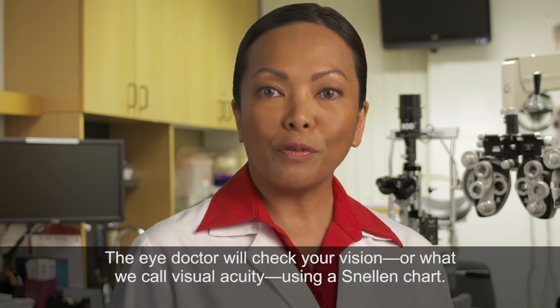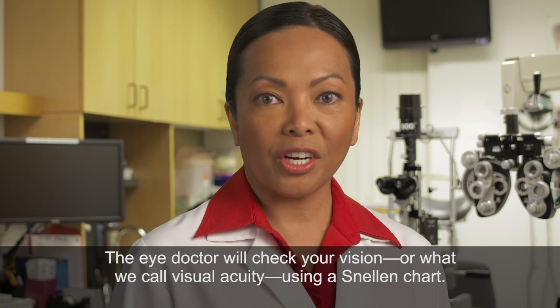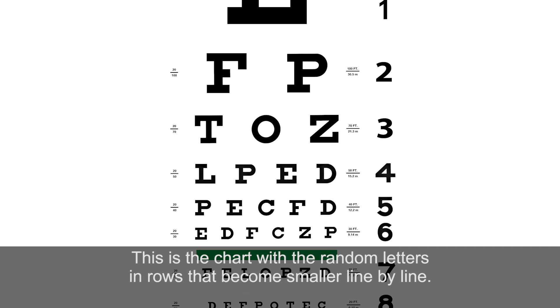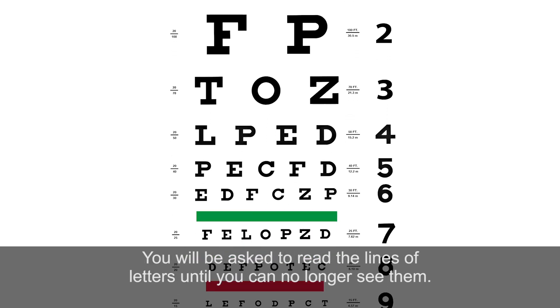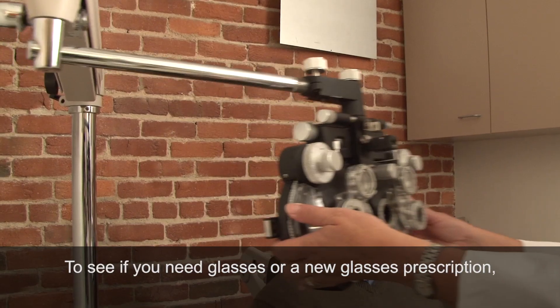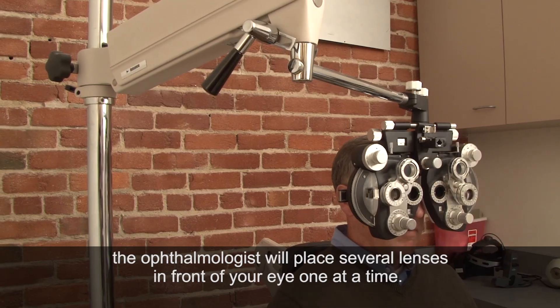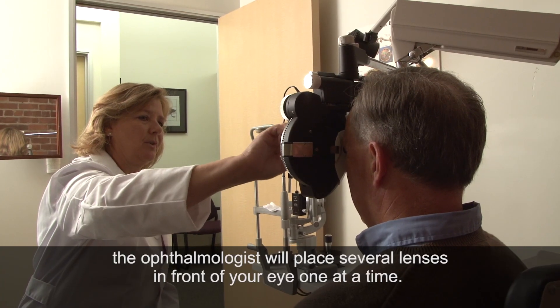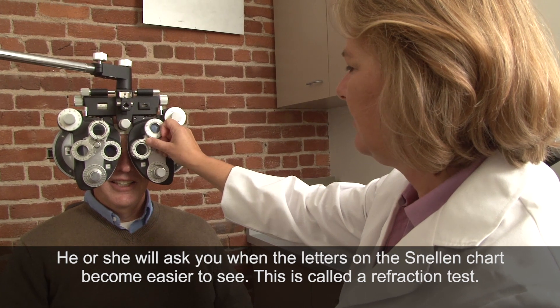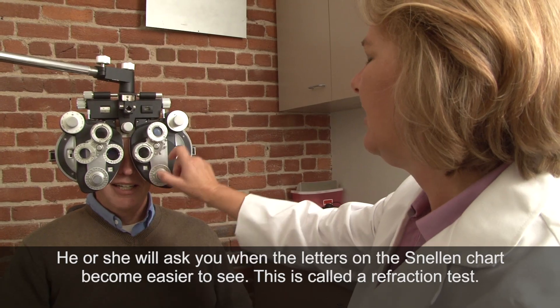The eye doctor will check your vision, or what we call visual acuity, using a Snellen chart. This is the chart with the random letters in rows that become smaller line by line. You will be asked to read the lines of letters until you can no longer see them. To see if you need glasses or a new glasses prescription, the ophthalmologist will place several lenses in front of your eye, one at a time, and ask you when the letters on the Snellen chart become easier to see. This is called a refraction test.